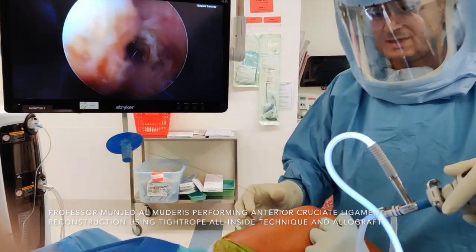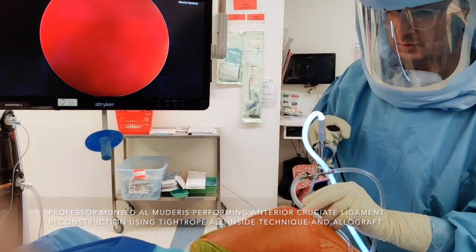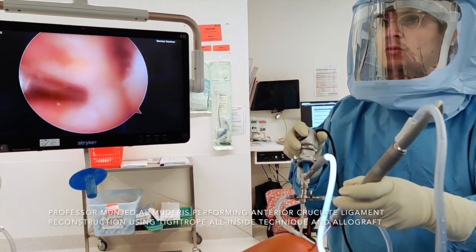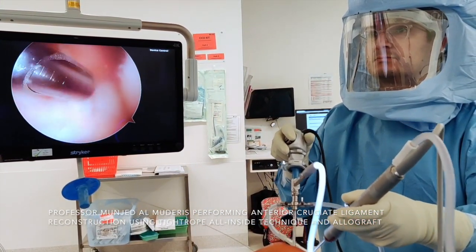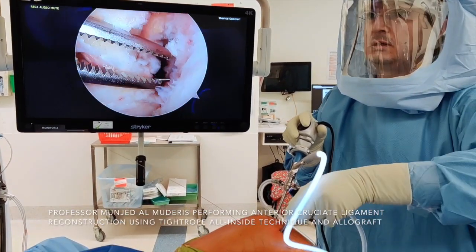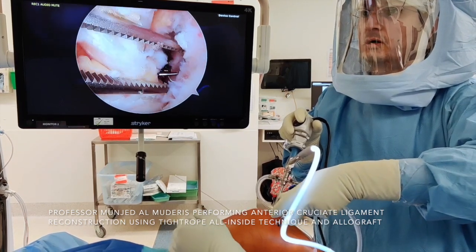I change my portal to the lateral portal and clean the debris from the joint so they don't form heterotopic ossification or a loose body. I retrieve the wire through the medial portal. You can use a retriever or a grasper for this step.